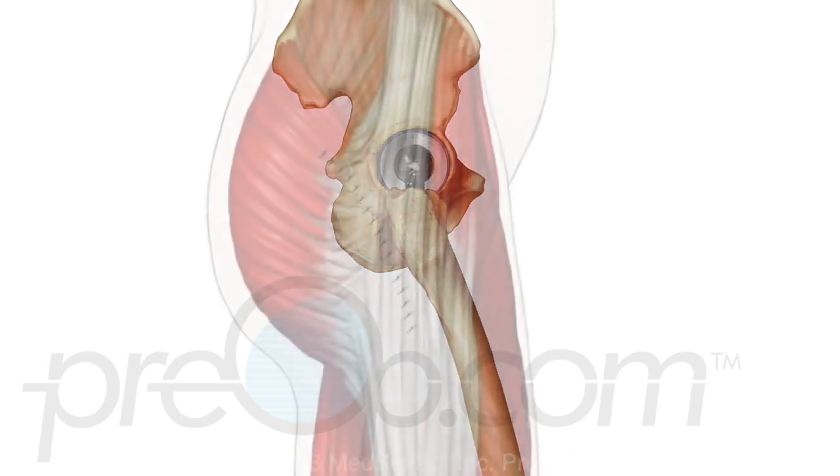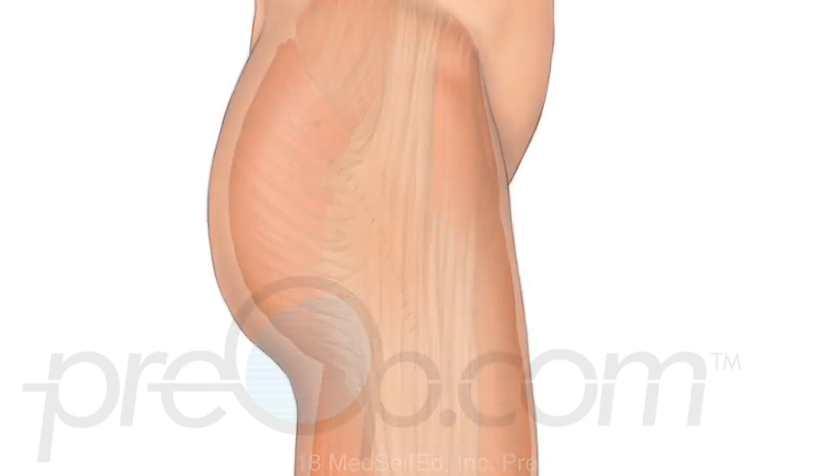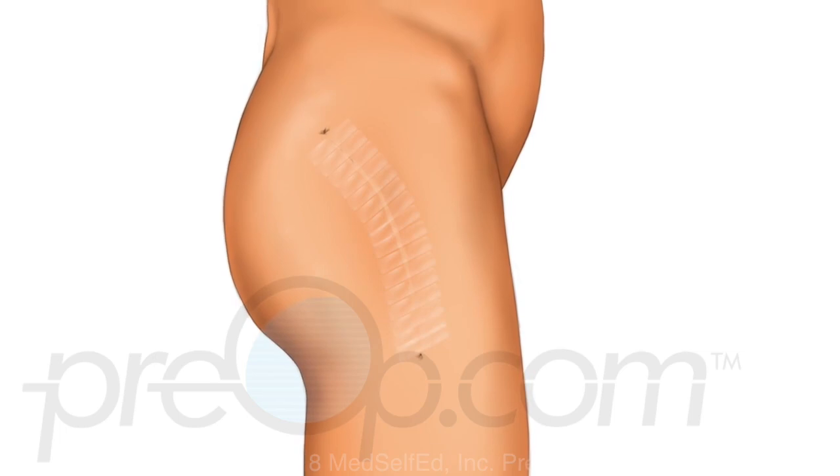The muscle and tendons that cover the joint are put back together. The surgical area is checked for bleeding and the skin is closed.